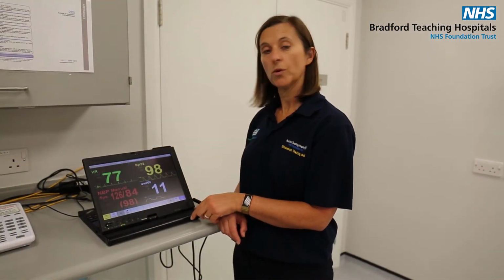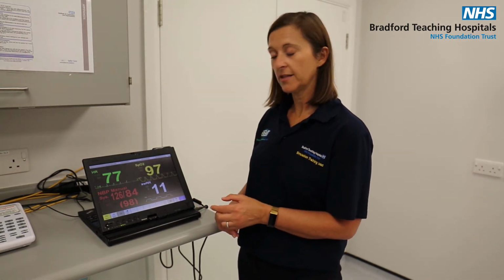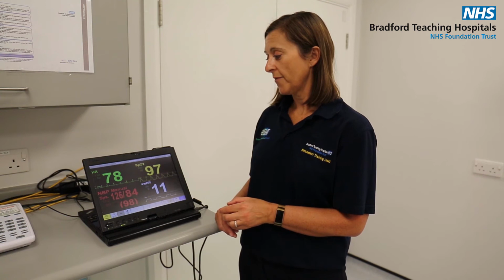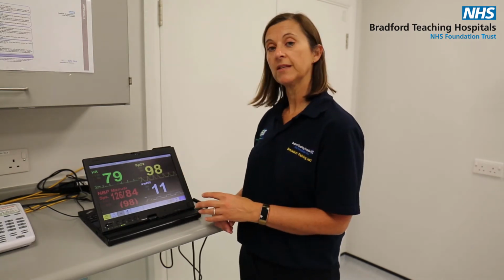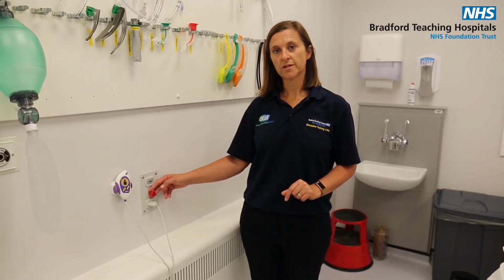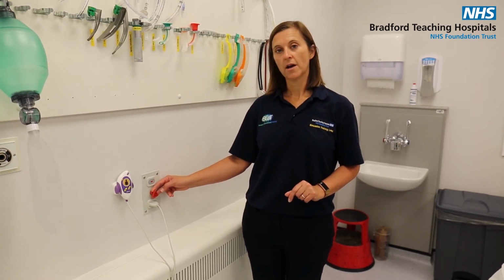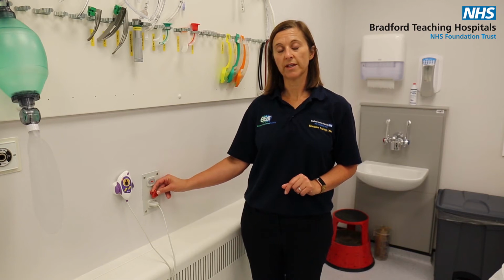So this screen here will work as your Dynamap. It will display your patient's heart rate, your blood pressure, the oxygen sats and the respiratory rate. Generally there will be a member of faculty in the room to help you with this piece of equipment, as we're not expecting you to be experts on the simulation equipment. So we have an emergency call bell, and that would work in exactly the same way as it would do in a ward or clinical area.